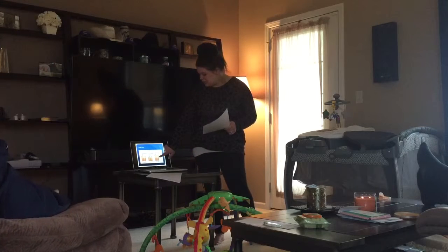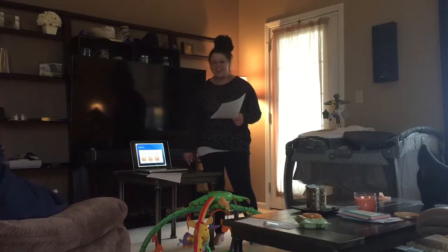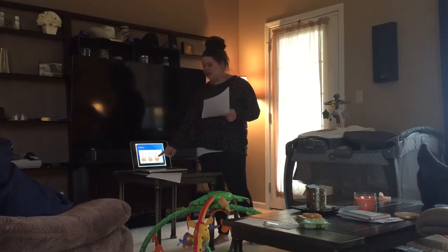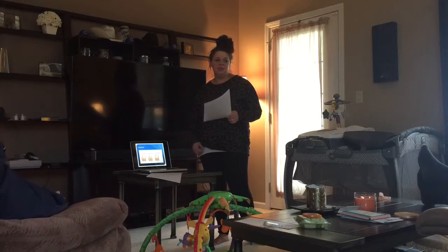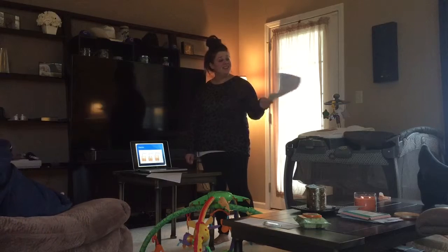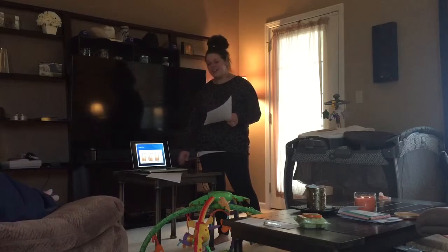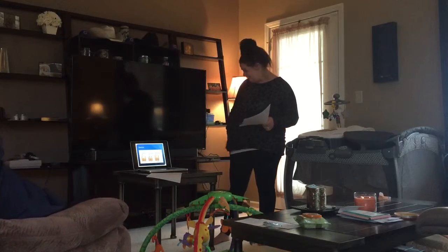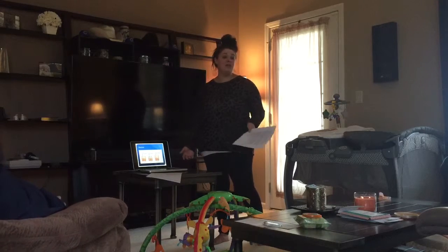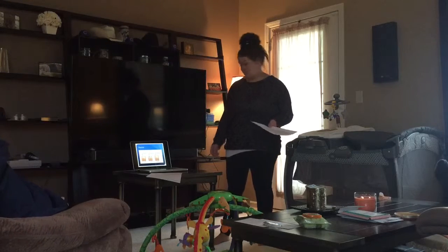How about on tooth C? 6. 9. There you go, 9. Now, can anybody guess what's going on with this tooth? There's some swelling. Infection. Might be some gingivitis. Very good. There is some swelling and inflammation, saying that there's gingivitis, possibly a periodontal disease. Any patient with a 9 millimeter pocket, there's definite bone loss and definite disease going on.